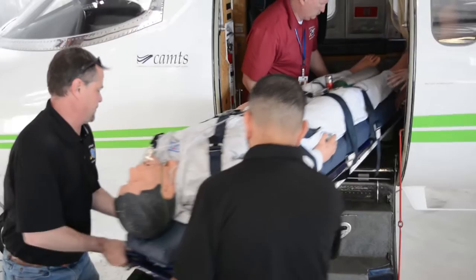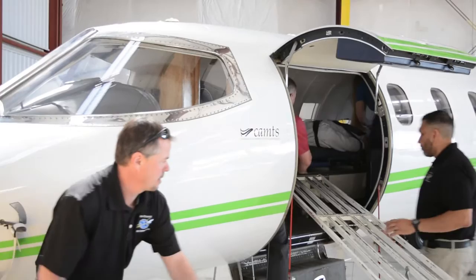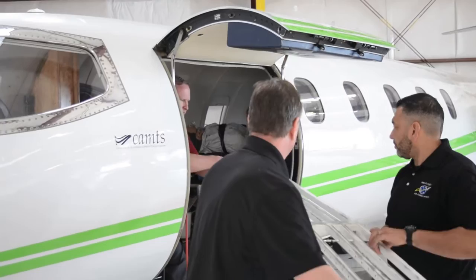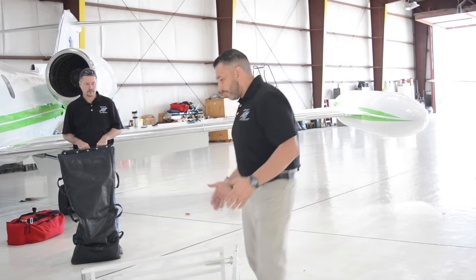Once the patient is on, we can just continue to slide upwards into the aircraft. So the gurney comes out of the way, and then we're going to go ahead and release the ramp out of place. And we want to make sure that if the patient was over 200 pounds, the ramp needs to come with us so that if we're continuing to another destination, we have the ramp. If we're dropping off, obviously, we want to make sure that we're taking the ramp with us.